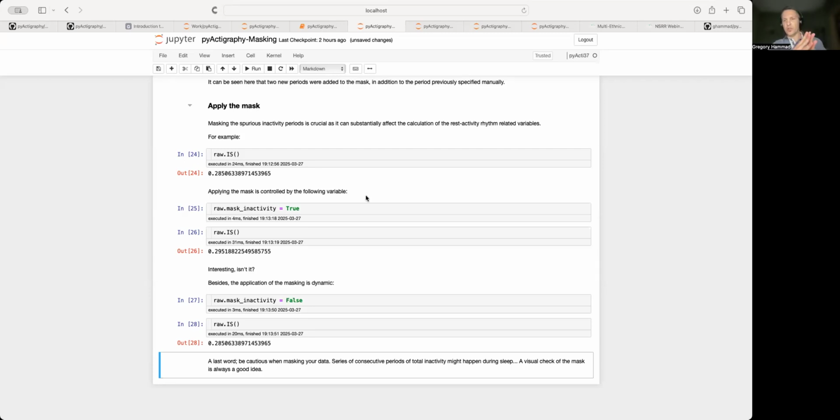So far, so good. Maybe I can see here a question. Is there potential for the use of extract actigraphy from an Apple Watch? Yes, maybe not Apple Watch, depends on the Apple, but if they provide a way to access their data. Fitbit is also something which is widely used, and there are ongoing efforts in trying to extract those.